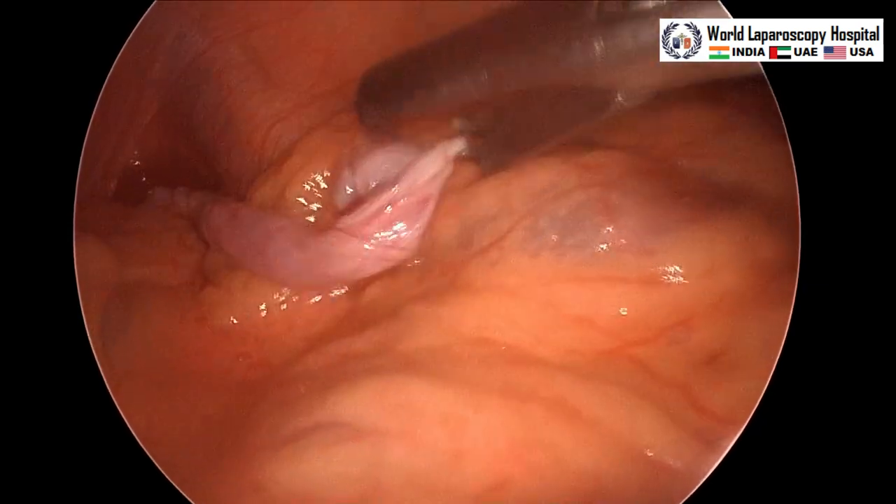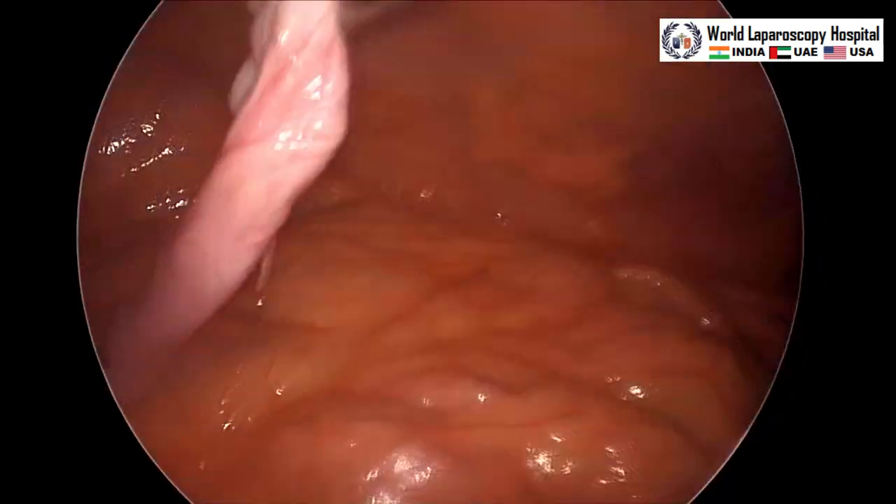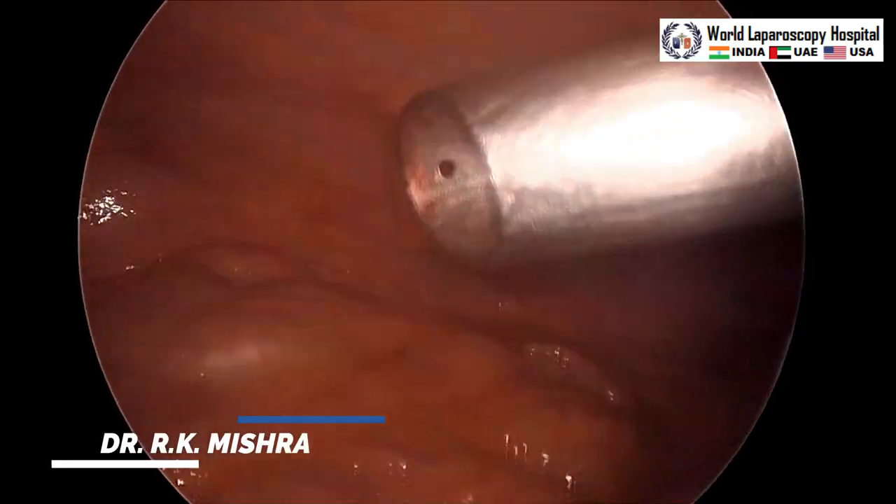This is the cystic wall — this is a 5 mm telescope and with the 10 mm umbilical port the cyst is taken out. Thank you very much for watching this video.